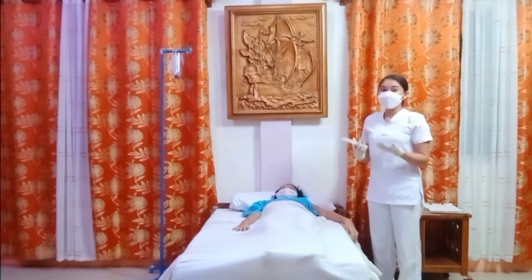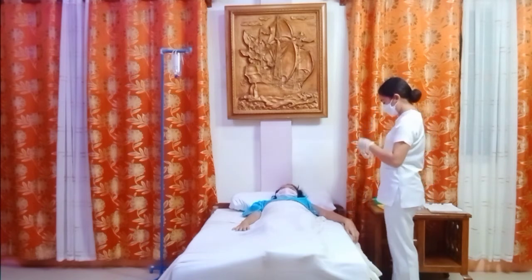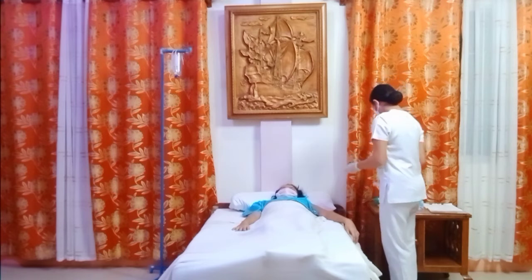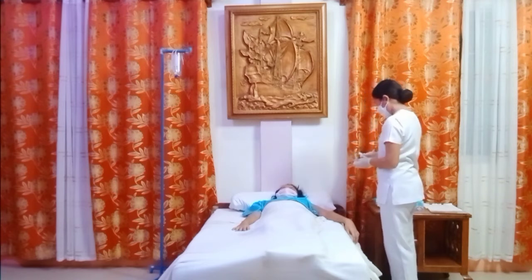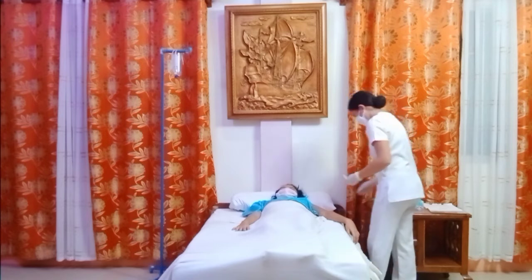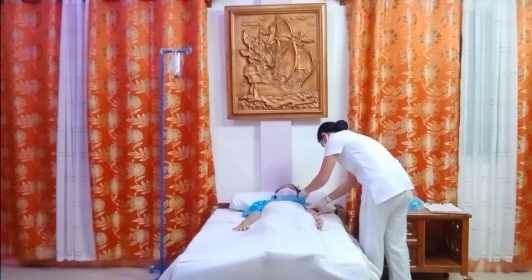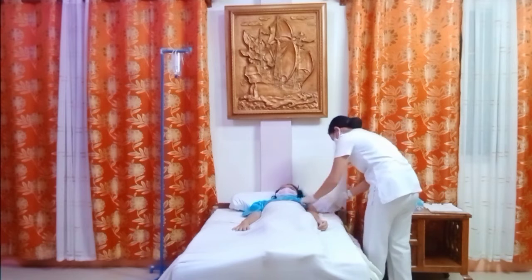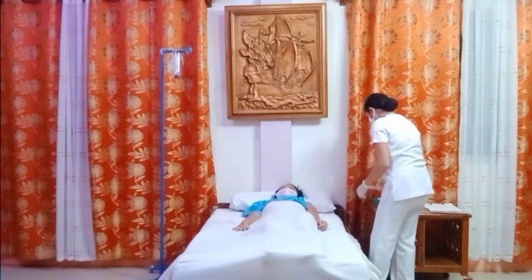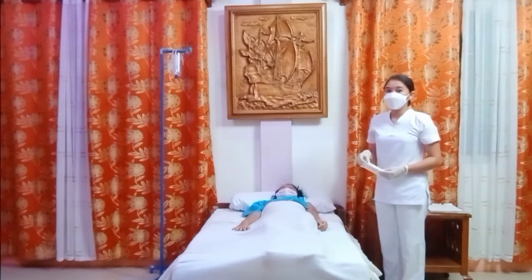Next is to place the bulb at the center of the axilla in order to attain accuracy. Next is to wait for the proper amount of time in order to attain accurate temperature reading.